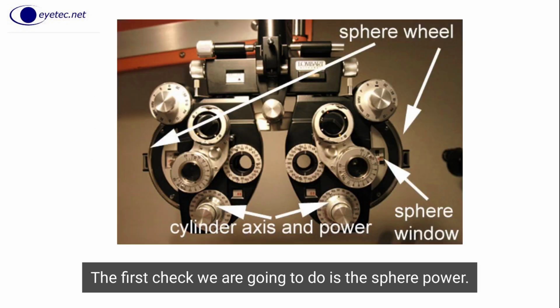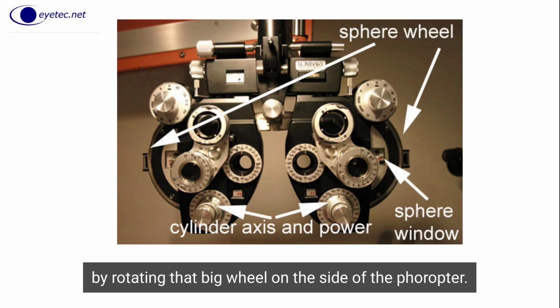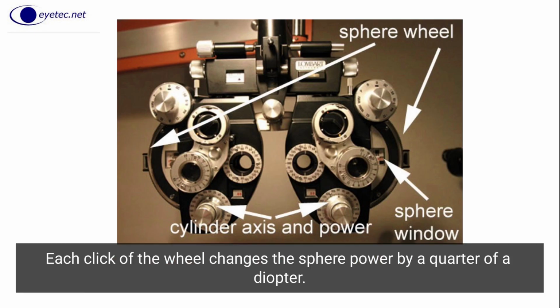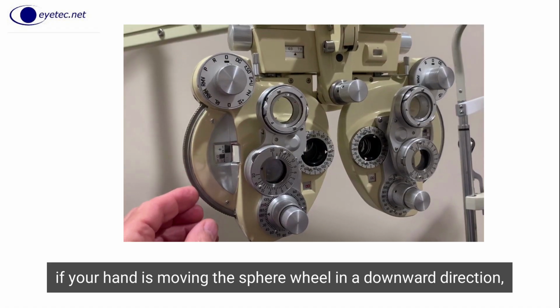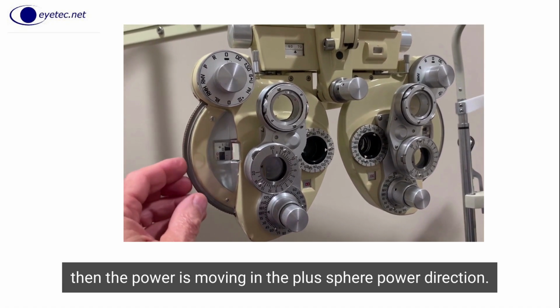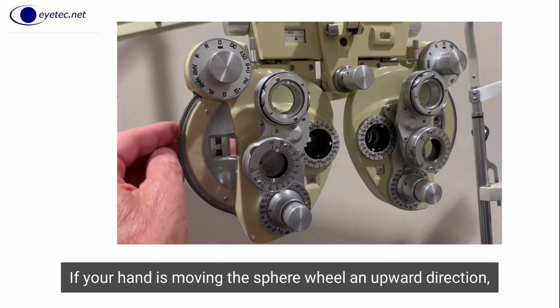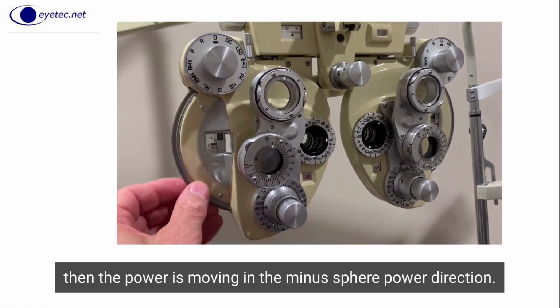The first check we are going to do is the sphere power. Remember that the sphere power is changed by rotating that big wheel on the side of the phoropter. Each click of the wheel changes the sphere power by 1/4 of a diopter. If your hand is moving the sphere wheel in a downward direction, then the power is moving in the plus sphere power direction. If your hand is moving the sphere wheel in an upward direction, then the power is moving in the minus sphere power direction.